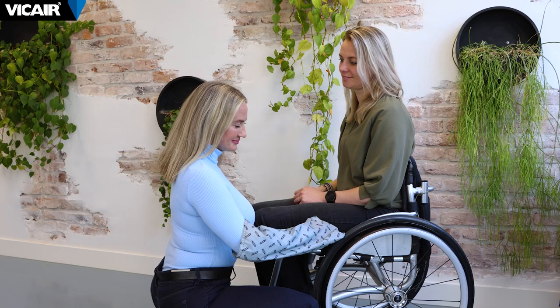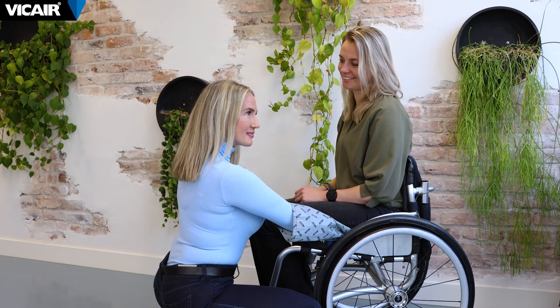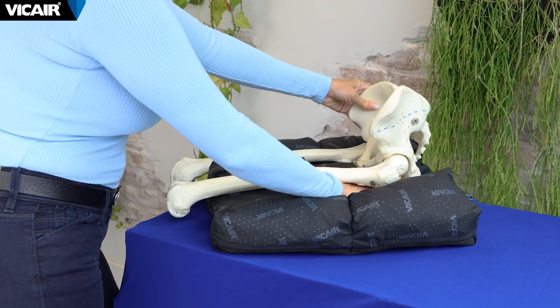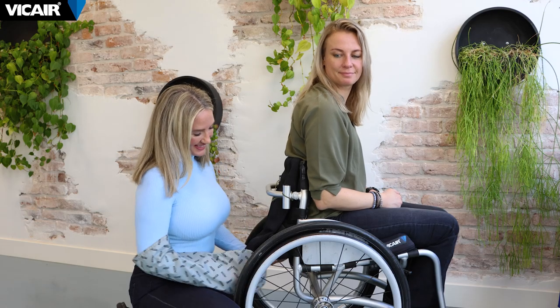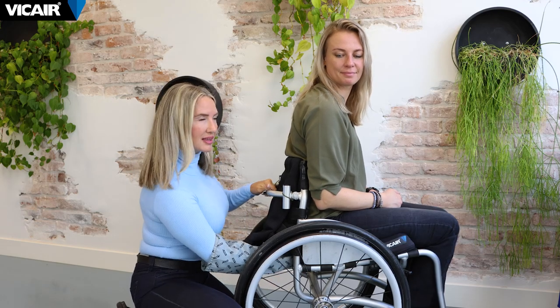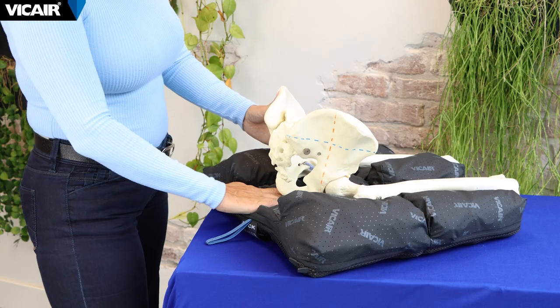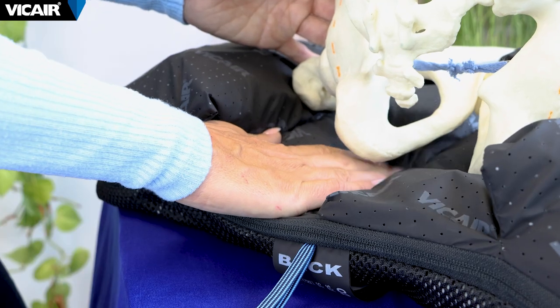You have side access: if you are able to remove the armrest, you can gain access through the side of the wheelchair. You also have rear access: this option can be used to gain access from the rear of the wheelchair, reaching between the backrest and the cushion.